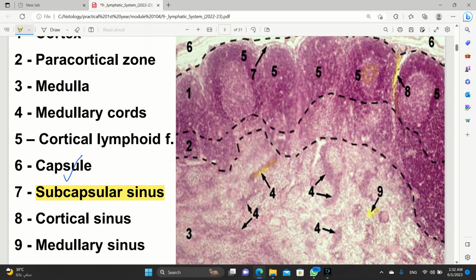Doesn't matter. That's the lymphoid follicle. And basically, again, lymphoid follicle or cortical follicle, it doesn't matter. The most important thing is that it is secondary. Basically, that's the paracortical region. That's the paracortical region, and that's the cortex, and that's the medulla.